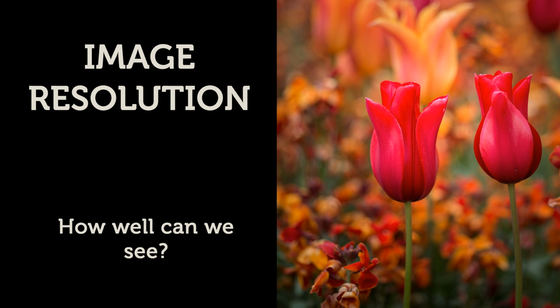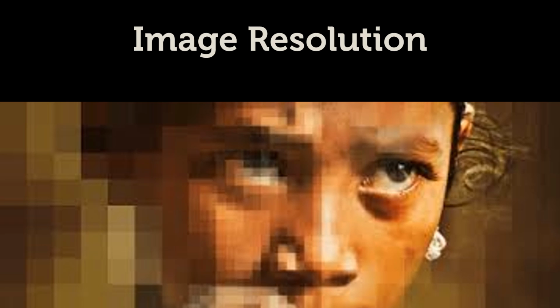Now we know what the parameters of ultrasound are, we will determine how they affect our image resolution. Image resolution is how well your system can define different anatomical structures, differentiate between tissue types, and display dynamic structures over time. There are 4 types of image resolution: spatial, contrast, temporal, and colour. We will cover spatial resolution in this presentation only.